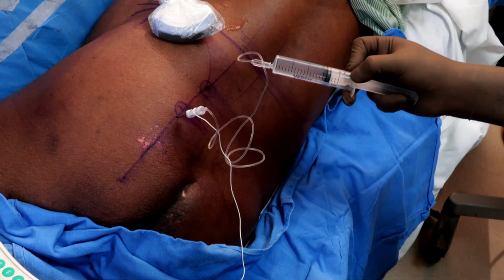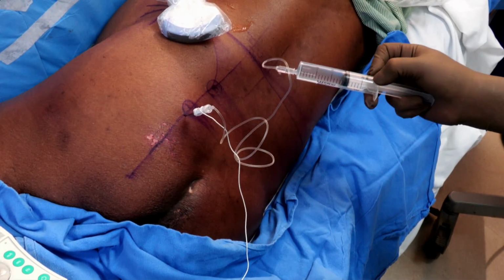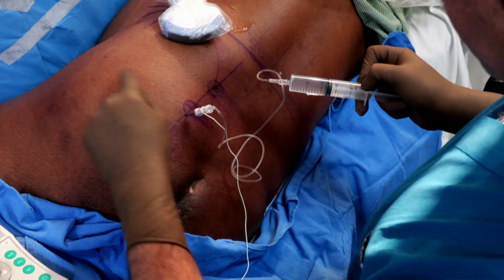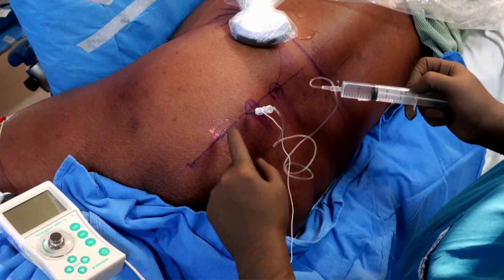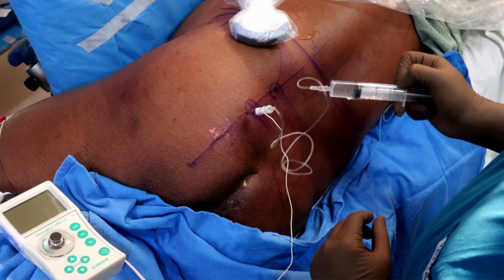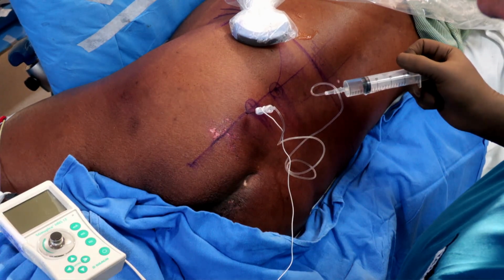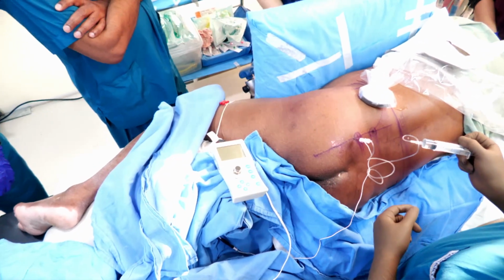You don't get any contractions anymore because of the ionic gradients. So again, you have to aspirate, keep on aspirating and injecting local. So sometimes you get gluteal contractions prior to reaching the sacral plexus because that's encountering the inferior gluteal nerve, which innervates the gluteus maximus, and that's the gateway to the sacral plexus. The moment you get gluteal contractions, the next would be the sacral plexus. So that we have already published, gateway towards sacral plexus.